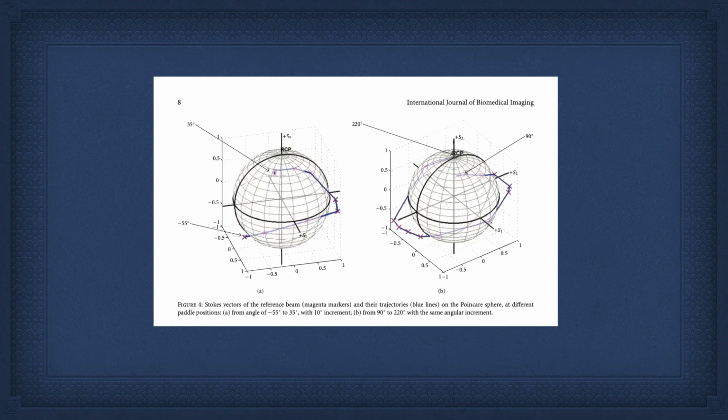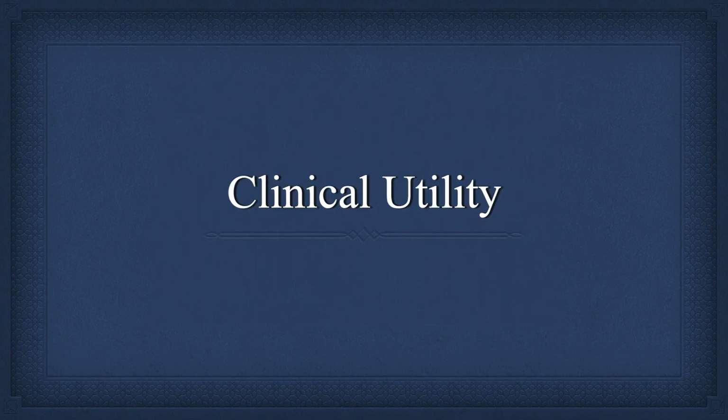We set up an original baseline sphere of three-dimensional polarization states, a Poincare sphere, and we can provide absolute values with this system if we choose to, but then we're just going to be more likely to introduce error. And if we're showing it's effective in diagnostics in vivo, particularly in orthopedics, then why would we go to a more complex system?